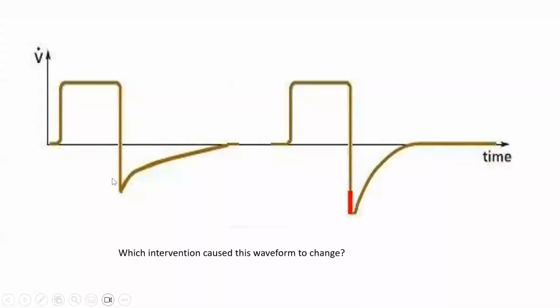Peak expiratory flow limitation is there. Expiratory flow limitation is there. Peak expiratory flow rate is low, ma'am, and also the time for expiration is increased. Very good. Okay, so there is definitely this part, this straight line below the baseline, that is what gives you your peak expiratory flow rate.